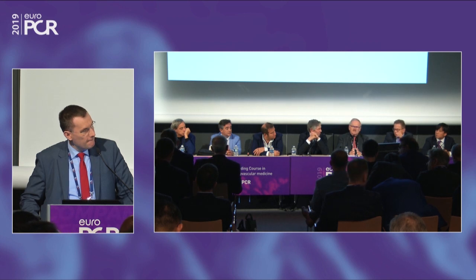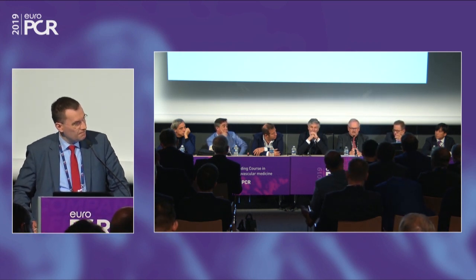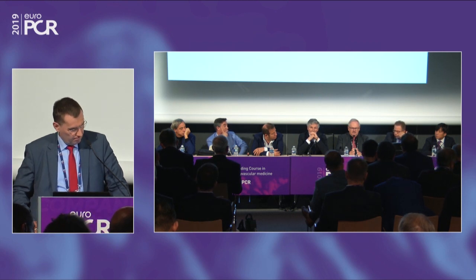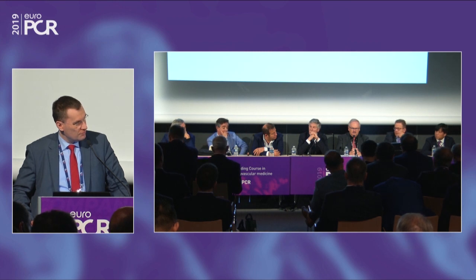It's safe. And the second very important issue is a good preparation of the ostium. So if you see that this is a very calcific, fibrotic lesion, it should be properly prepared. Without this, as Dobrin said, there will be only problems.